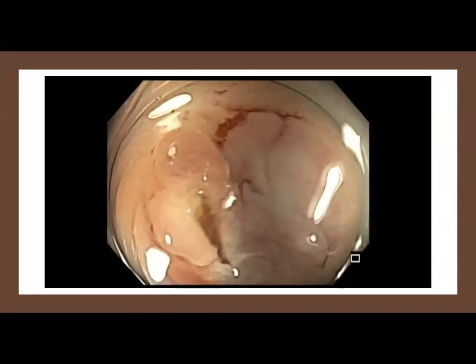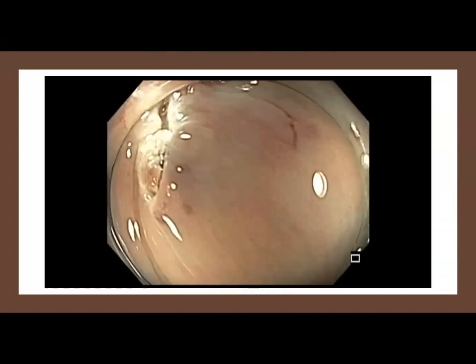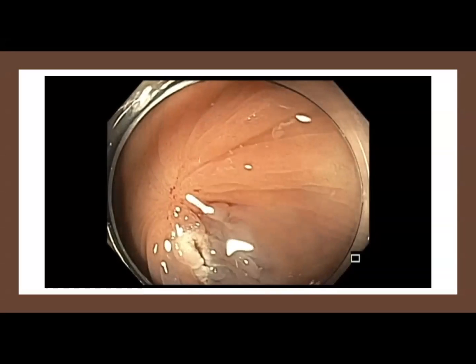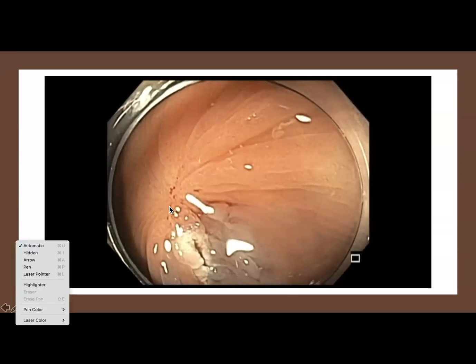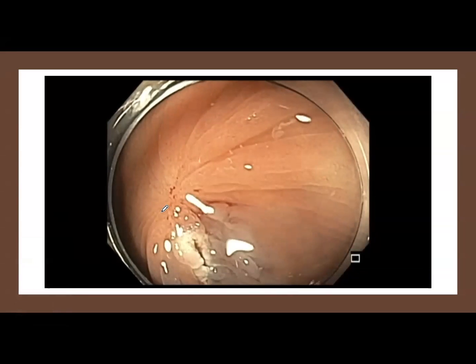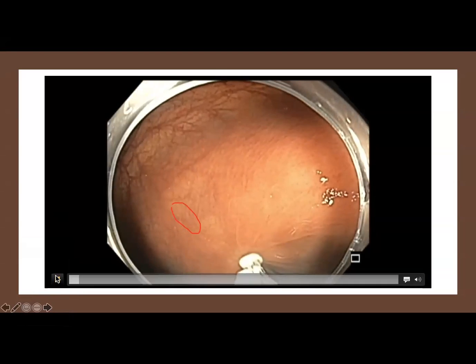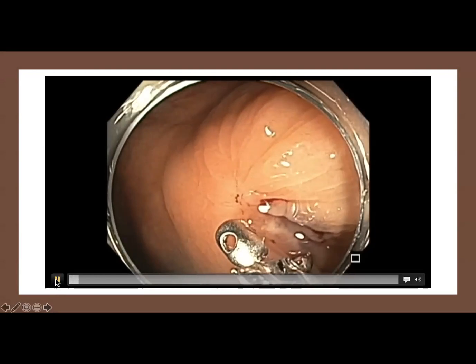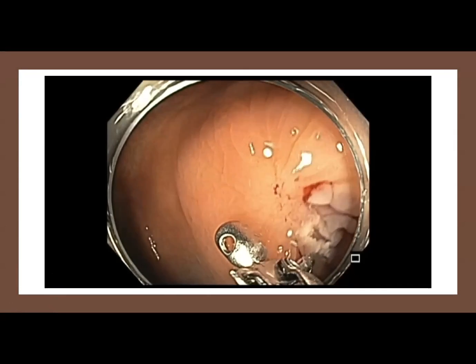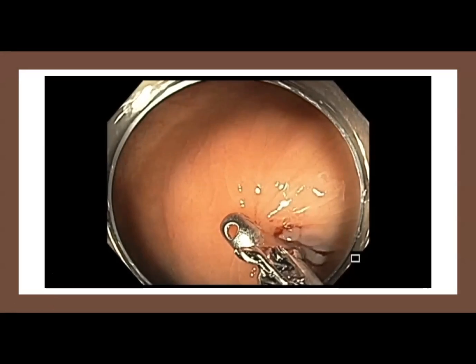So now you would need to APC it, maybe towards the center of the scar. There's just a little nodule there. Right here, right? Yeah. And this is scar and this is the polyp, right? All right, so this is what I've done. I basically went in with a hot biopsy so that I can take that out to be absolutely sure.